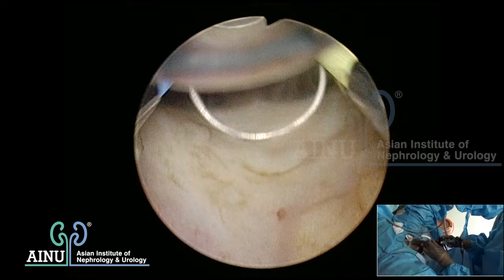There are many ways of doing a resection. My way is Nesbitt's method: I create a groove at the 11 o'clock and 1 o'clock positions. As the groove is created and you march towards the capsule, a vessel gets exposed which needs to be coagulated. This is the vessel that gets coagulated. Here are the bladder neck fibers and the surgical capsule - that means I have reached my limit of resection and should not resect further.